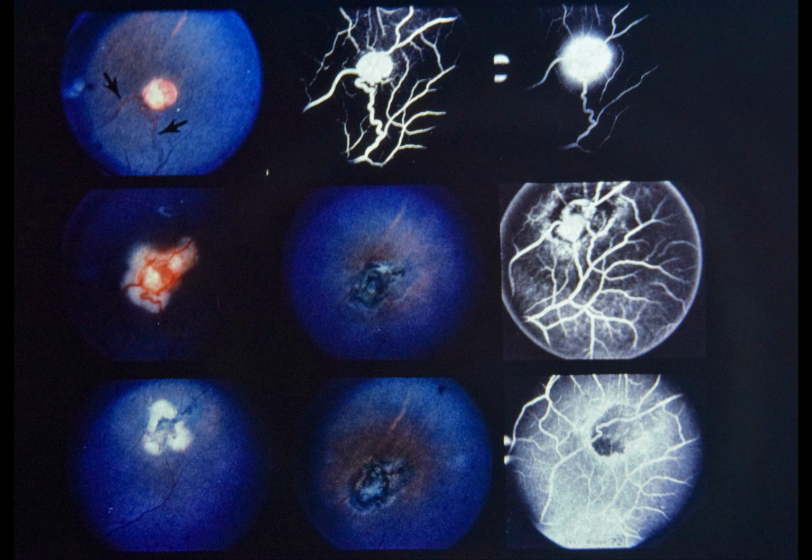Repeat fluorescein angiography at this time disclosed patency of vessels in tumor and dye leakage into retina, as seen center right. For this reason, additional xenon arc photocoagulation was performed, lower left. 3 months after the second treatment episode, note chorioretinal scar, lower center. Fluorescein angiography now shows no patency of vessels in tumor, lower right. This patient has maintained 20/16 vision and has shown no tumor recurrence for 2 years.